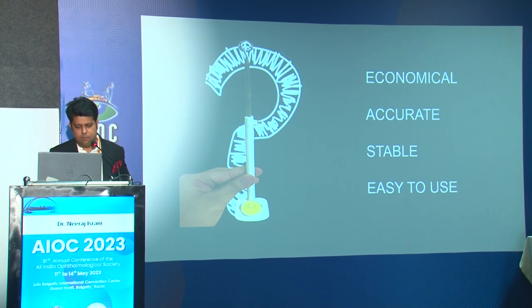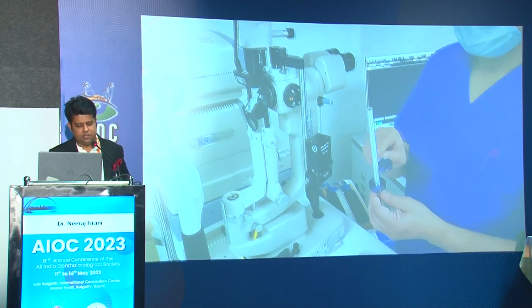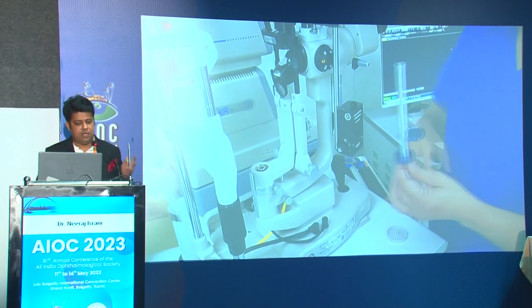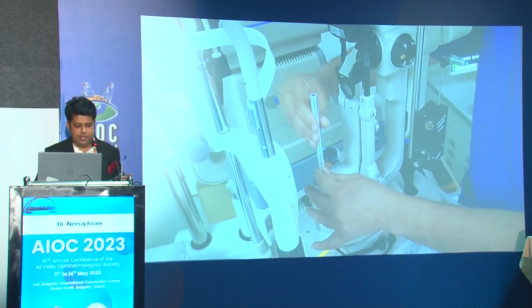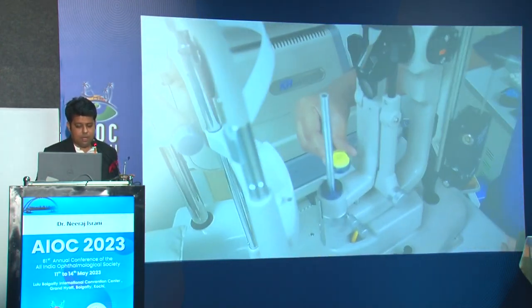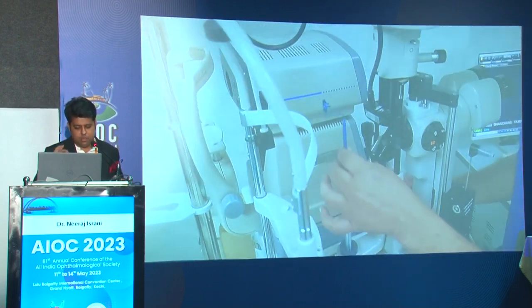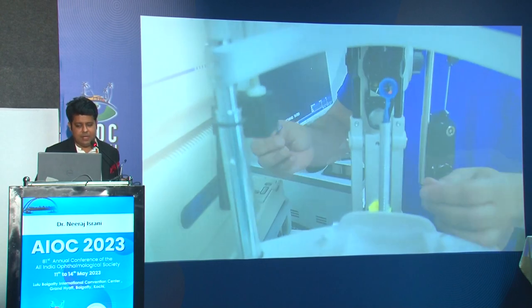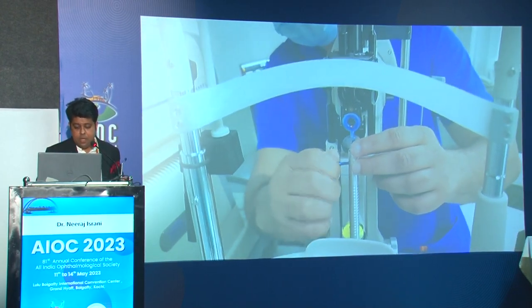We were able to come up with an economical, accurate, stable, easy-to-use marker. The final device is now available in the stalls at Epsilon for everybody to try. You just put it in the calibration slot — this is a bubble marker, it's centered. You put the toric marker in and screw it up. The dial is much smaller now, so you don't even have to avert the eyelid much. You mark the axis with the blue marker, take it, and it indents the eye.